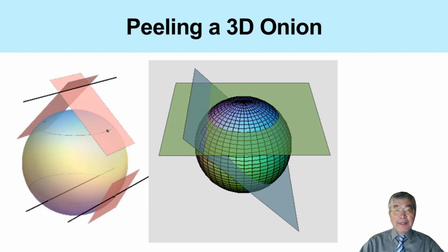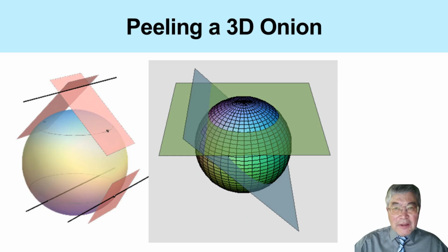Once the outer shell has been determined, we can conceptually peel it away. Then we move inward to the next shell. Since the contribution from the already known outer layer can be accounted for, the next layer can also be recovered. By continuing this process shell by shell, we can reconstruct the entire three-dimensional object. This is not meant to be a practical reconstruction algorithm, but it gives us an important intuition. With sufficient projection information, the internal three-dimensional structure is encoded in the measured data and can in principle be recovered.